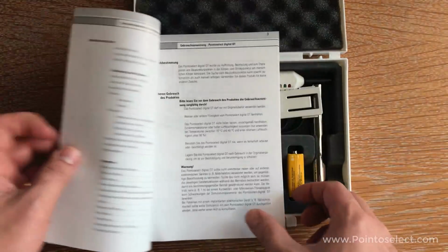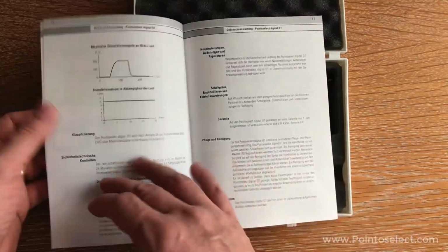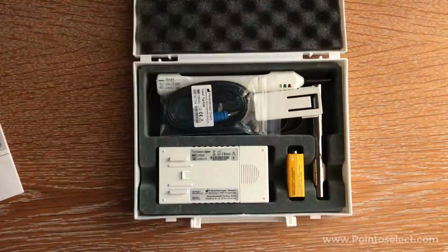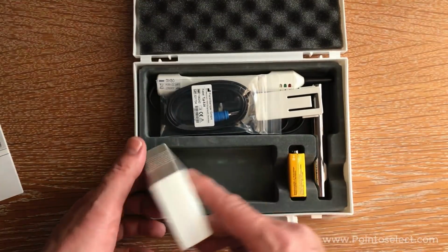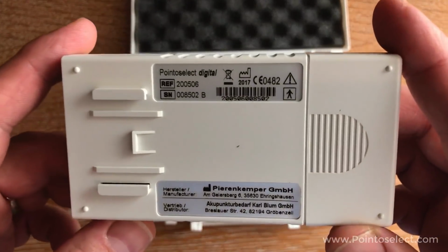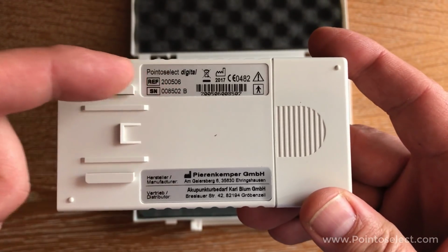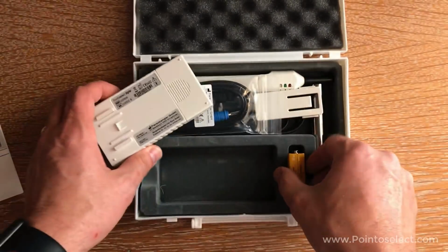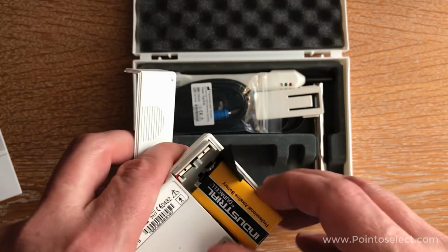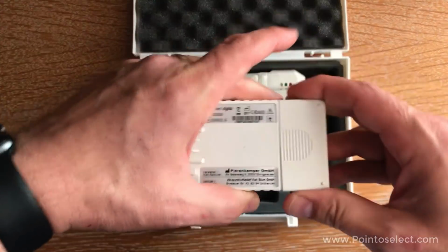We've got a paper manual here, black and white, written in German. Looks like a translation of the prior Chinese. Okay, good. What else do we have? Oh, this is interesting. So here we've got our Pointoselect, and on the back we've got the name of a manufacturer and the name of a distributor, all in German. Good. Let's see, we've got battery. Let's get that put in there. Let's see if this is going to be the same. All right, there we go.